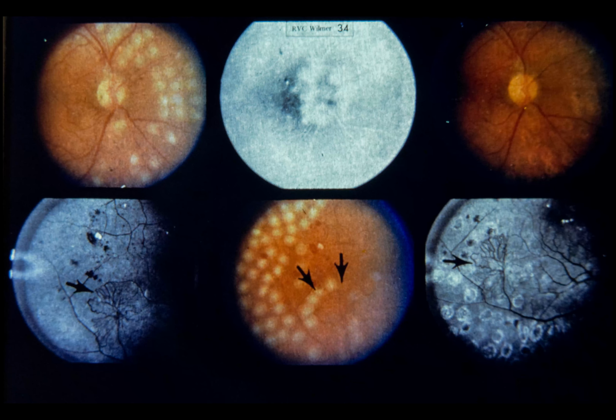Slide 34. Scatter argon laser photocoagulation for diabetic neovascularization. This 38-year-old white female has had diabetes for 20 years. Visual acuity was 20/20 in each eye. Fundus examination disclosed disc neovascularization and retinal neovascularization in both eyes. Upper left, note disc neovascularization in photograph taken immediately after scatter argon laser photocoagulation. Note that no photocoagulation burns were applied directly over disc vessels.